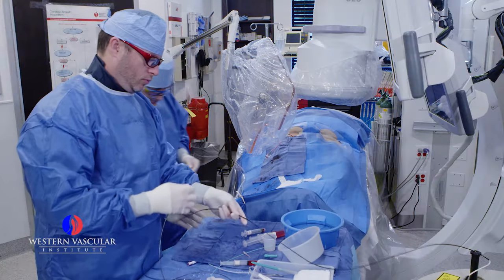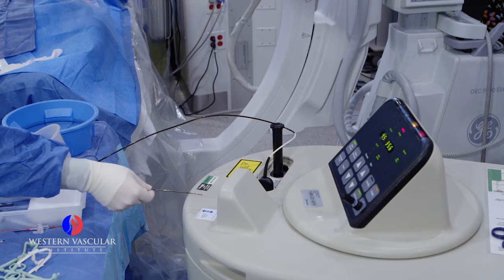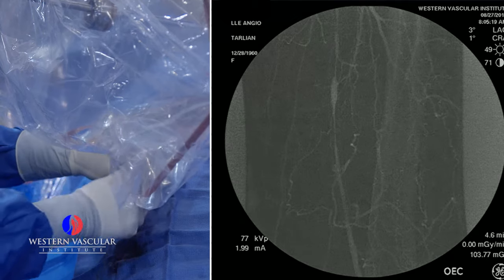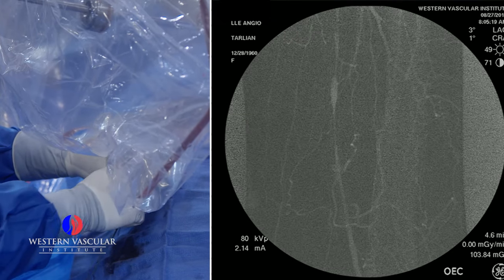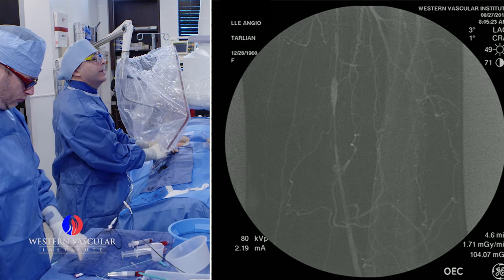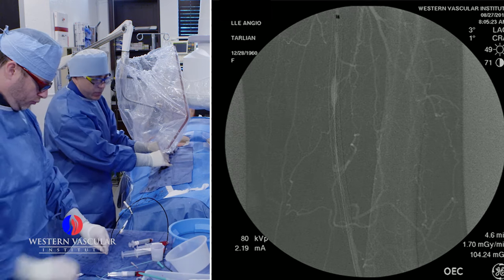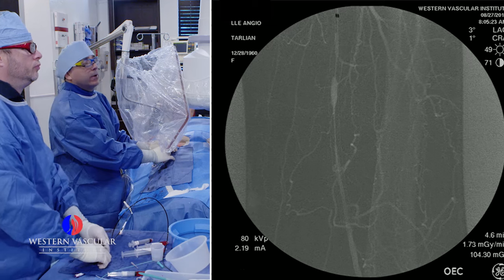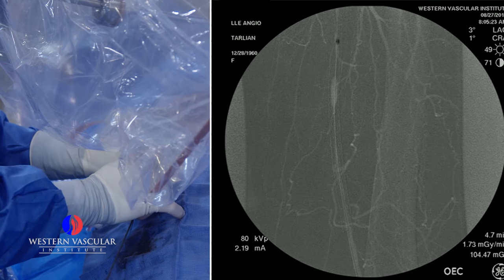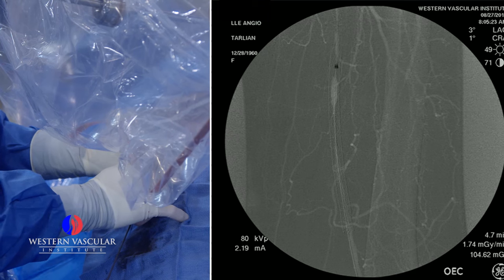Now we're going to calibrate the laser. Now we're going to advance our laser fiber and you'll be able to see it in just a minute as it comes up and over. We're going to treat the narrowings in the artery. You can see it at the very top of the screen — a little black mark. We're going to go nice and slow through that area, and the laser will vaporize the plaque inside the stent. Very good for treating this problem.